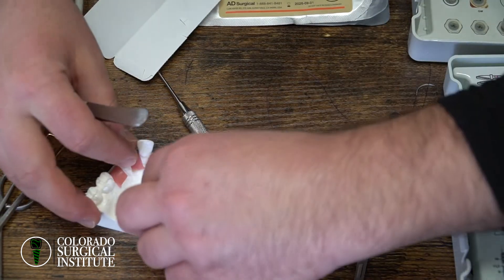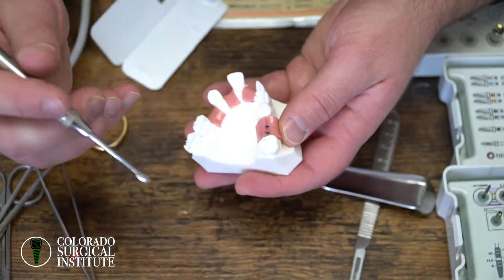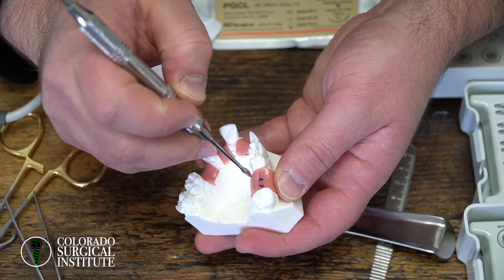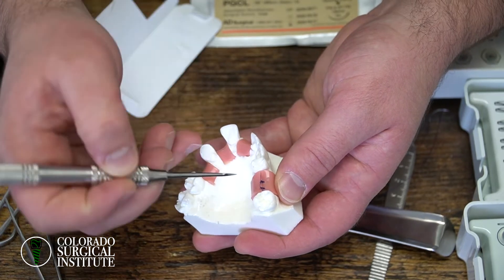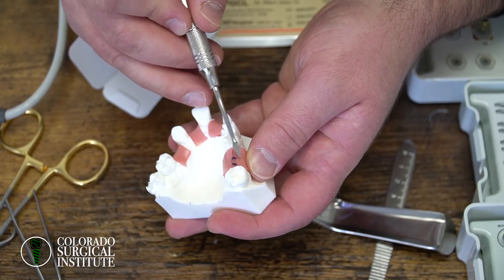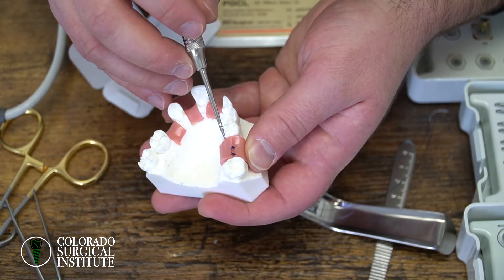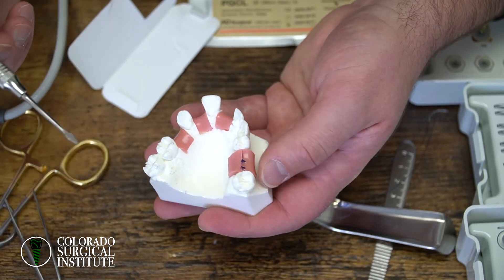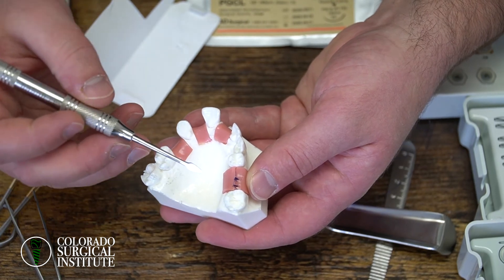For alternative sutures, you could do a horizontal mattress: start on one side, go in towards the buccal, out towards the lingual, then cross to the mesial side, go in towards the lingual, out towards the buccal, and tie it right there. That hikes the tissue up. Then I'd recommend placing a simple interrupted over the top — usually two of them. The horizontal mattress lifts the tissue up, and the simple interrupted presses the tissue down. Especially if you have vertical releases, it's important to integrate a horizontal component along with a simple suture to tie the tissue down.